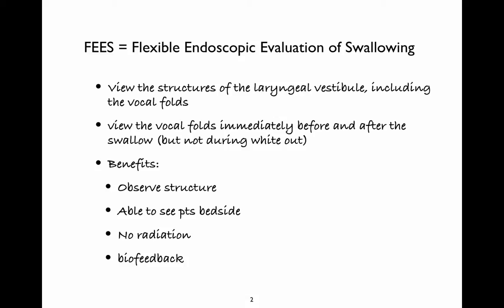So, in this methodology, you can actually see the surface of the vocal folds and all the other structures in the laryngeal vestibule and beyond.